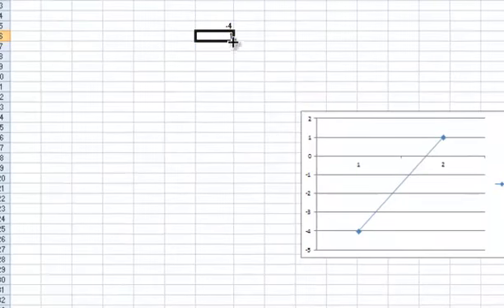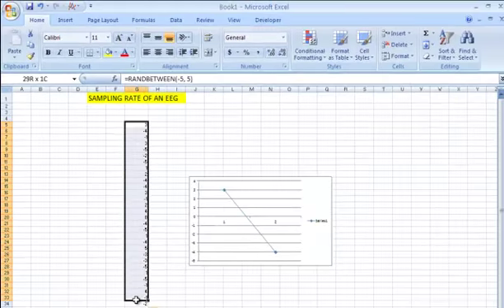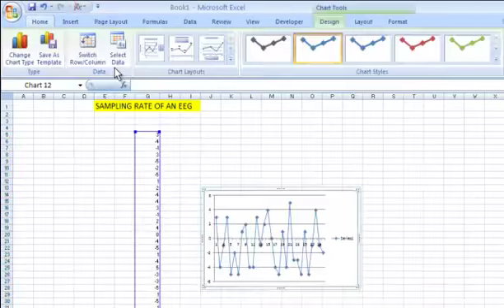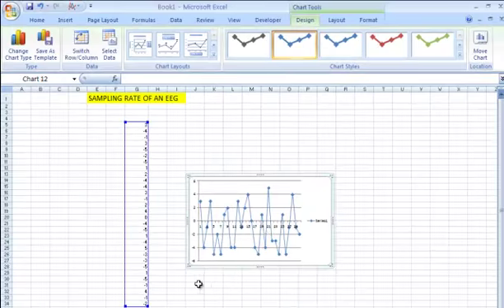So let's do that here. We'll take this and we'll have more than 24 samples here, and we'll graph these samples together, and we should be able to see at least 8 waves. 1, 2, 3, 4, 5, 6, 7, 8, 9. This is higher. So to be able to resolve alpha waves of 8 Hz, we need to have a sampling rate, so these are all the samples of at least 3 times the frequency of interest. So in this case, a sampling rate of 24 or higher.